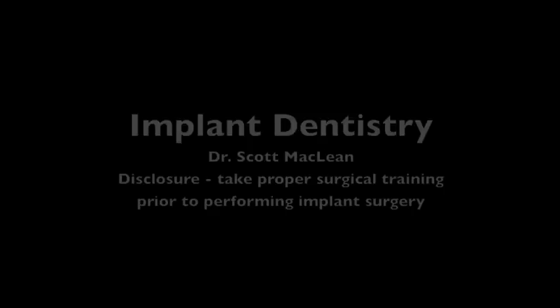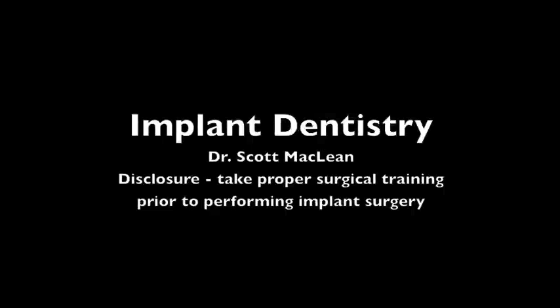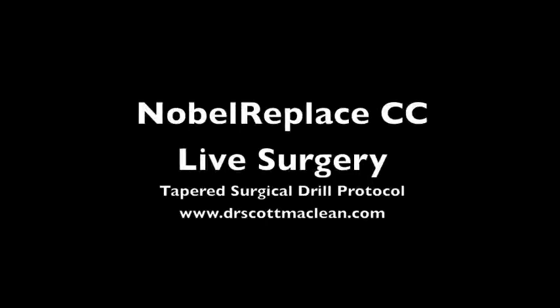Hello, this is Dr. Scott McLean, and this is a YouTube video about implant dentistry. Our topic today will be the tapered surgical drill protocol using the Nobel Replace CC Implant.